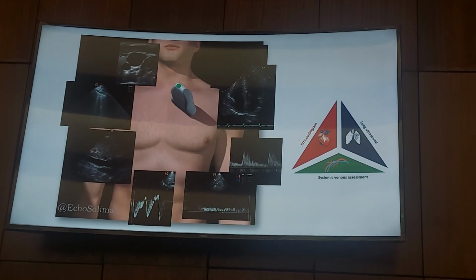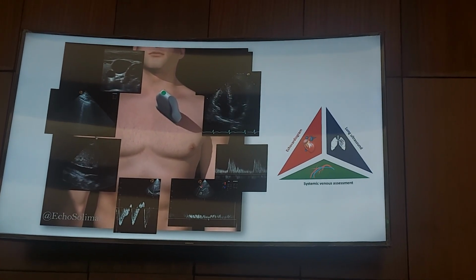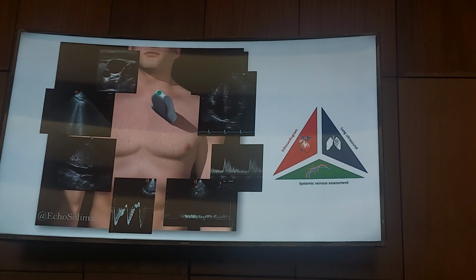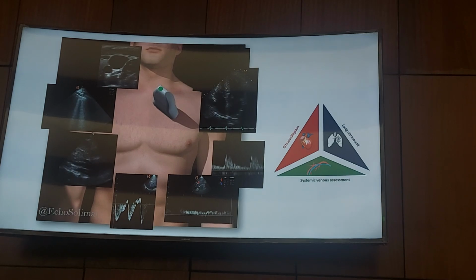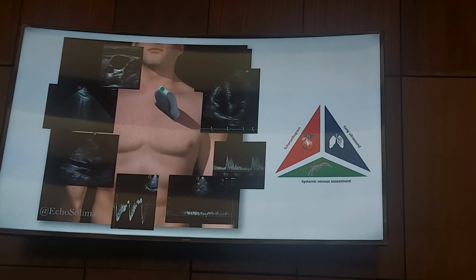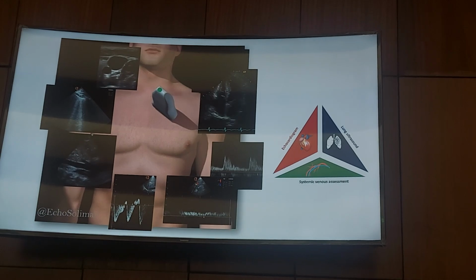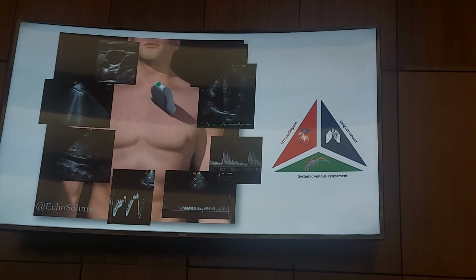So you scan every space. Anterior, because pneumothorax goes up against gravity, so you always scan up. In congestion, you always start at the base and go up. Pneumothorax, you start mainly anterior, because this is where you see the evidence of the air. Did I answer the question?